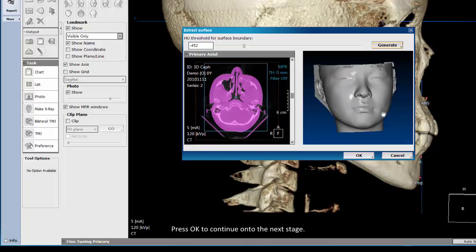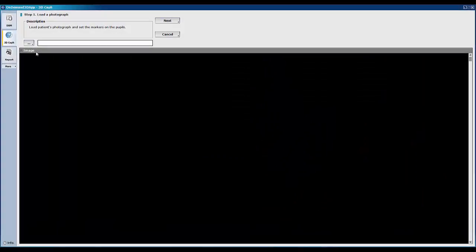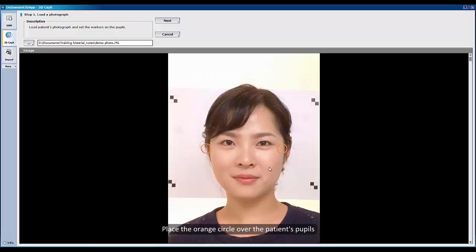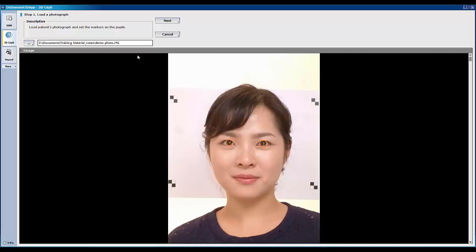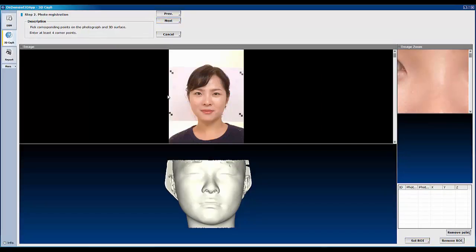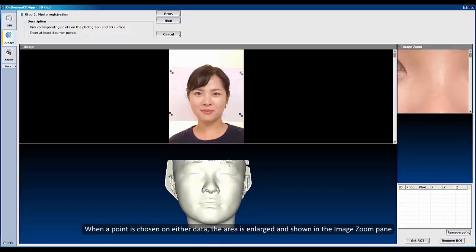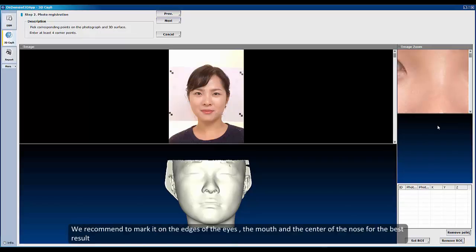When it is ready, click Generate to render a surface area model of the patient. Press OK to continue to the next stage. Press this button and load the patient's photo. Place the orange circles over the patient's pupils, and then click Next to proceed. Pick at least 4 corresponding points on the photo and the surface model. The area is enlarged and shown in the image zone panel. We recommend marking points on the edges of the eyes, the mouth, and the center of the nose for the best result.